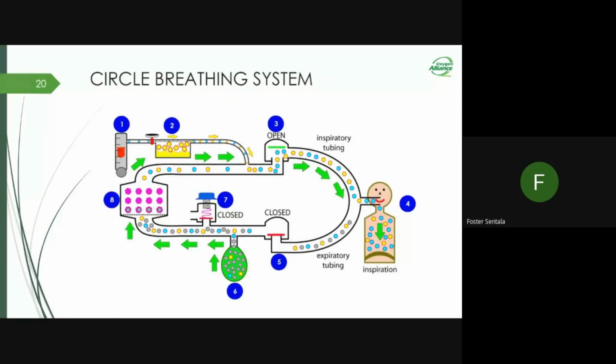So it should not be that confusing, because I also stated earlier on that this diagram represents a rebreathing circuit, but our model, the UAM in focus, does not use a rebreathing system.